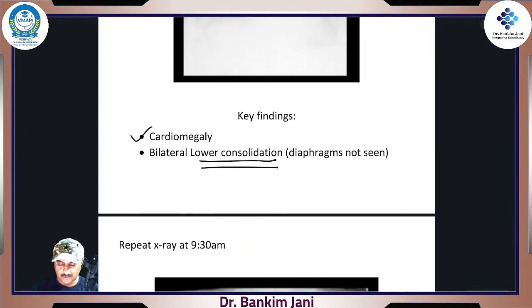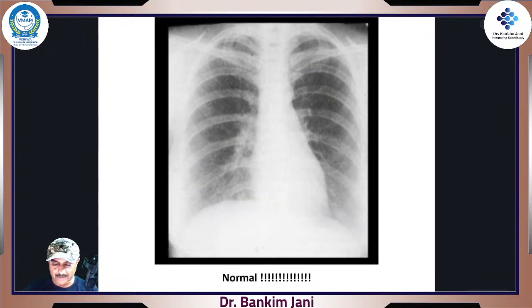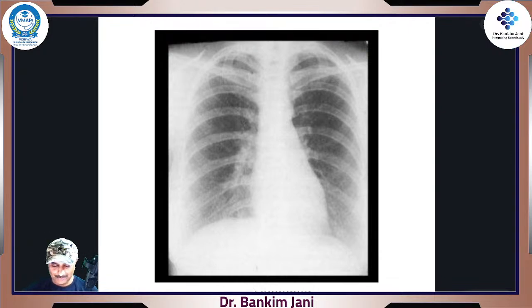At 9 o'clock, the department starts officially. At 9:30, once again the X-ray is taken, and this is good, right? Within 2 hours, the patient has improved so much. Everything is fine, right? We can see the dome of the diaphragm. The heart is completely normal, right? What magic! What happened in 2 hours?